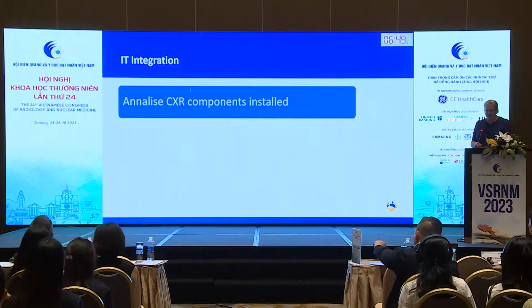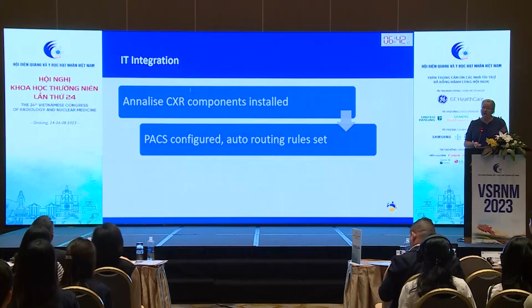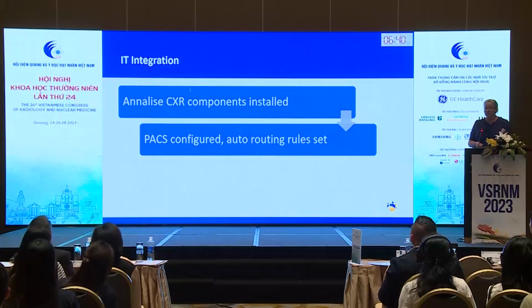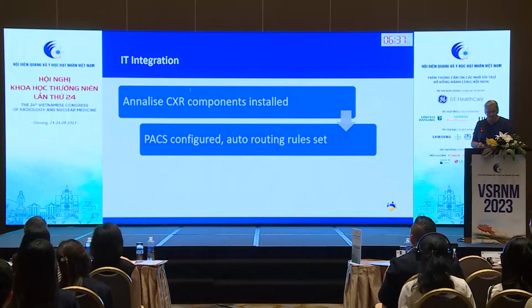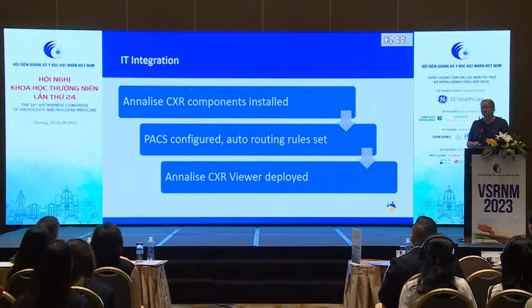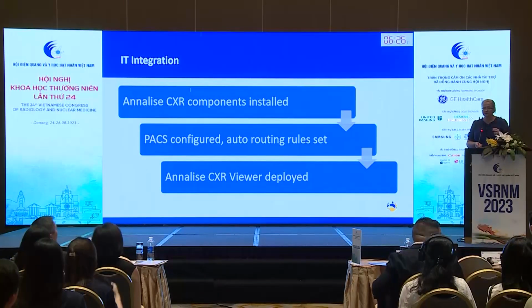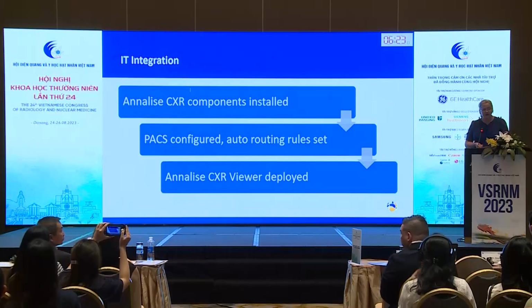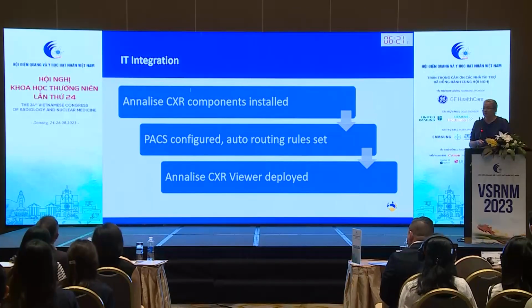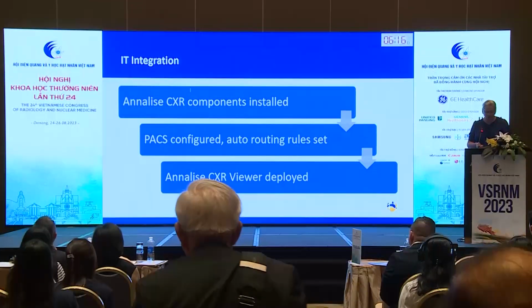With the IT integration, we identified the different components of the AI product. We configured our PACS to automatically route cases to the AI. And then we deployed the viewer software to our radiologists. And that sounds very simple, but it was strong engagement from the IMED IT department and the Annalise integration team made that happen very smoothly. So your IT team is very important.